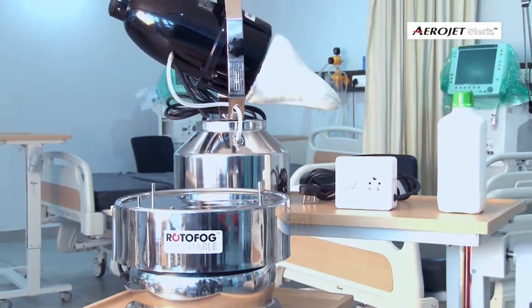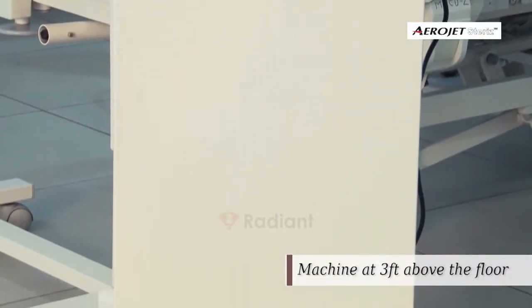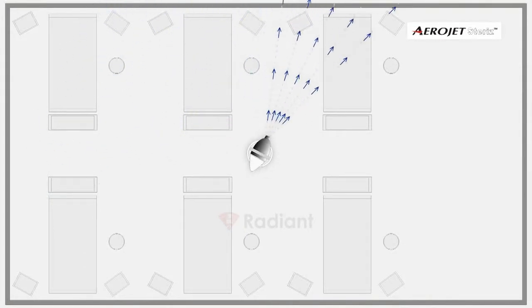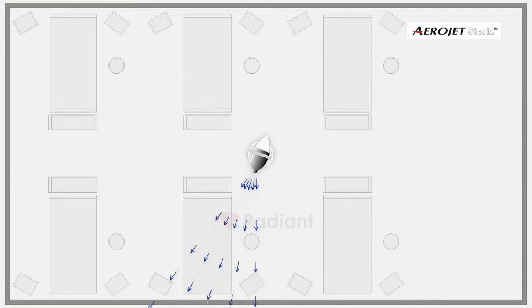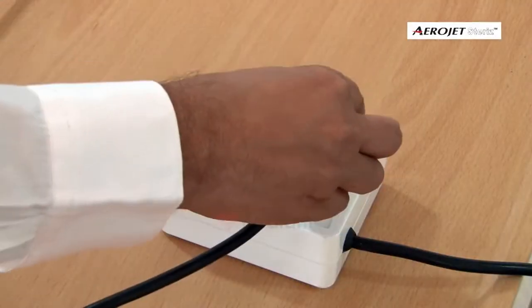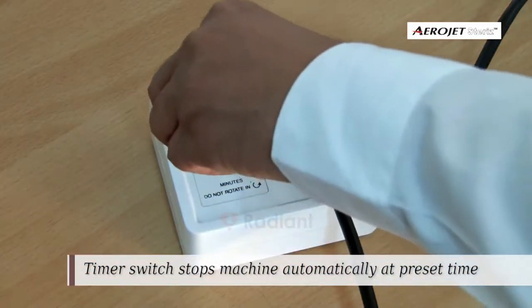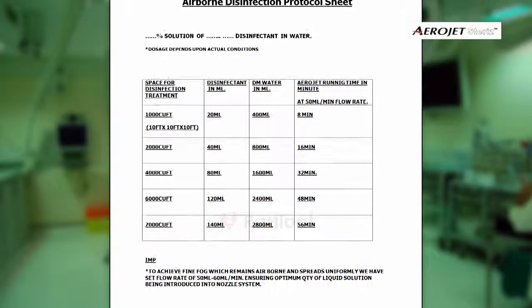For installation of Aerojet with Rotofog: if you are planning to use Rotofog with Aerojet, place Rotofog on a steady table at three feet height, preferably in the center of the room. Place Aerojet on it and make the necessary power connections. Set the time knob in a clockwise direction to a time value determined from the protocol sheet.